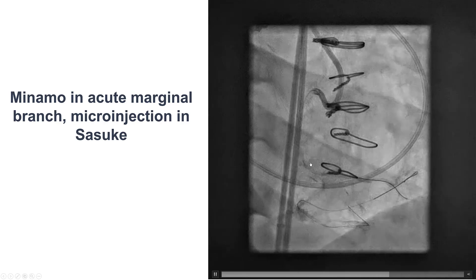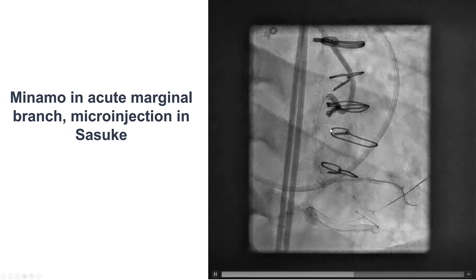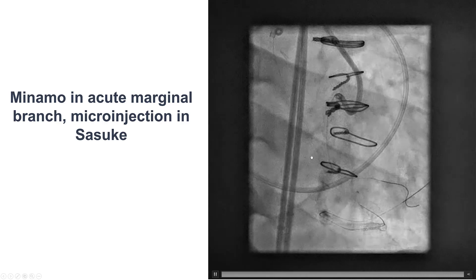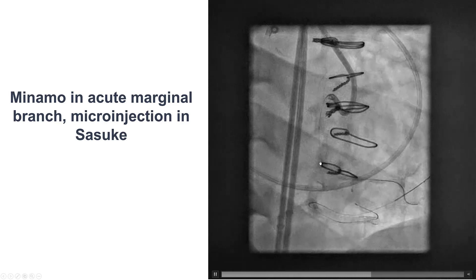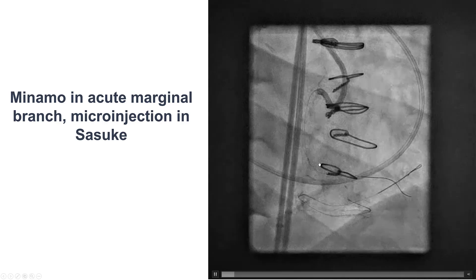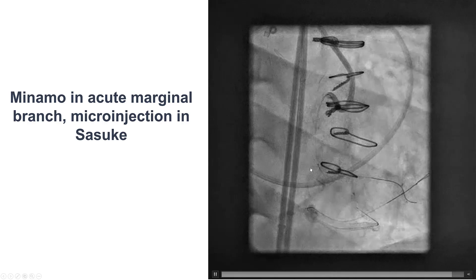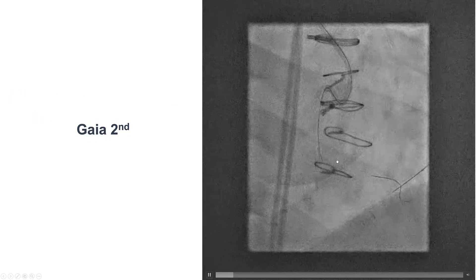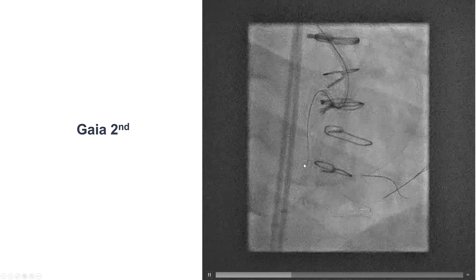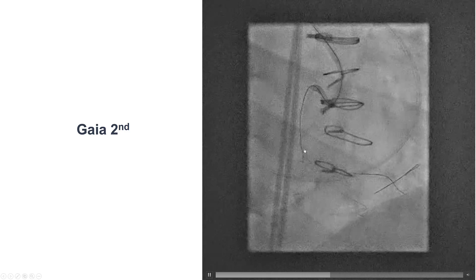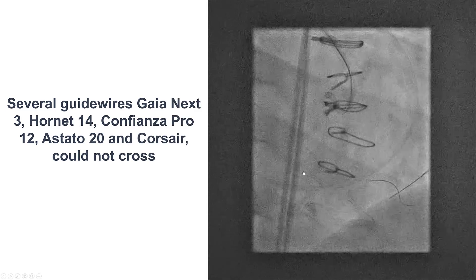We now moved on to the actual crossing of the CTO. As planned, we tried antegrade wire escalation. We placed a workhorse wire into an acute marginal originating next to the proximal cap, and then used a dual-lumen microcatheter in an attempt to penetrate the proximal cap. Despite multiple guide wires, including a Gaia Second, there was inability to advance through the very calcific proximal cap.